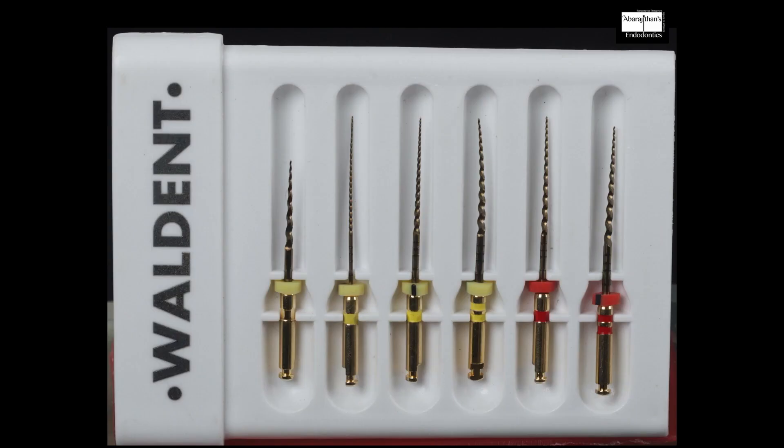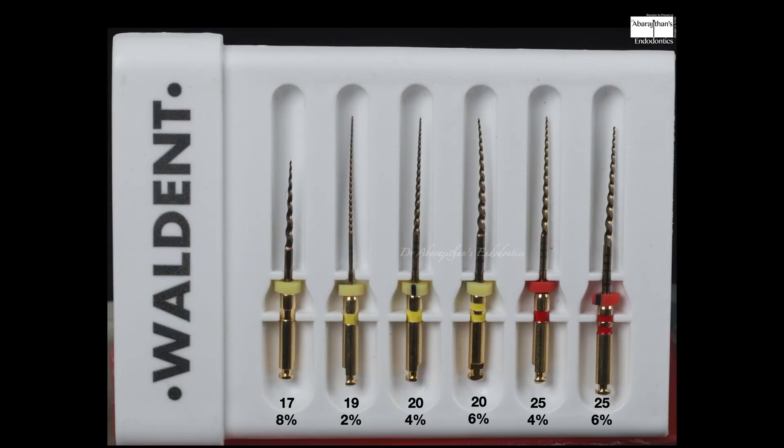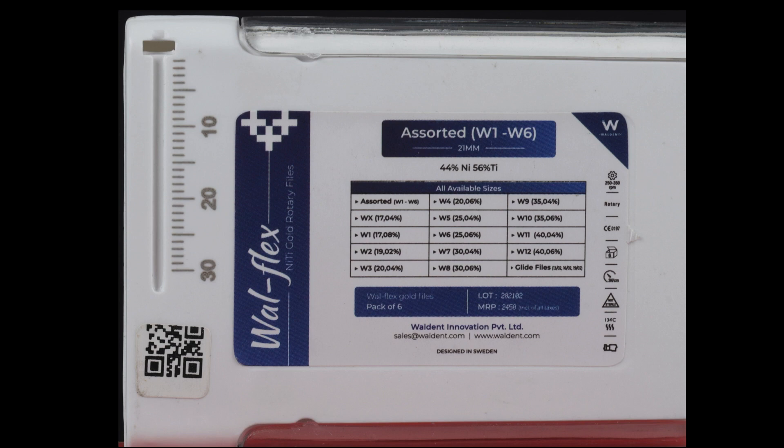This is how we received the sample — assorted box. Apart from the initial starter pack, the files are also available as individual sizes. In this assorted pack they have sizes W1 to W6, which is a 17/0.08 orifice shaper, 19/0.02 for rotary glide path, 20/0.04, 20/0.06, 25/0.04, and 25/0.06.